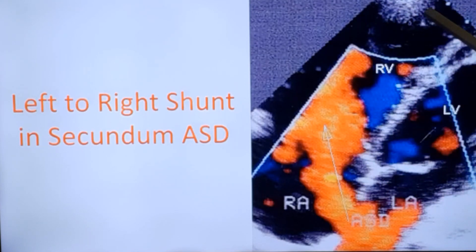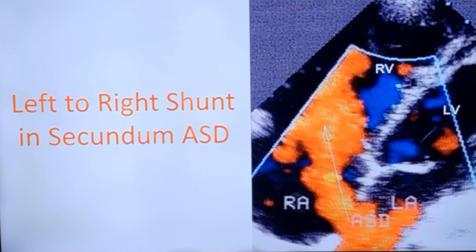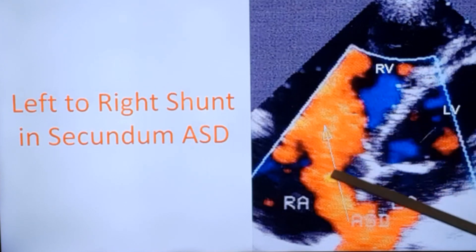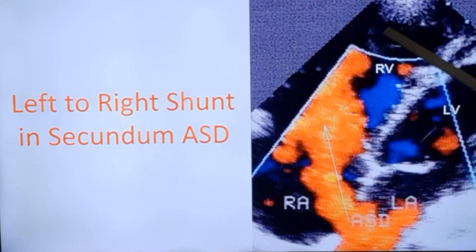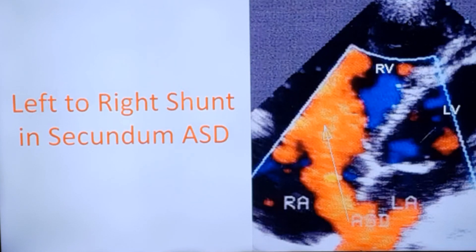It is a slightly tilted apical four-chamber view with the apex slightly towards the left. Left ventricle, right ventricle, right atrium, left atrium — the ASD is seen here. This is the left-to-right shunt across the atrial septal defect, seen by color Doppler echocardiogram.